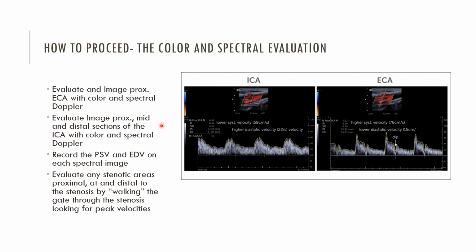If you happen again to come across a stenosis, specifically in the ICA, you want to walk your gate through the stenosis and make sure that you're obtaining the highest velocity for your calculations.